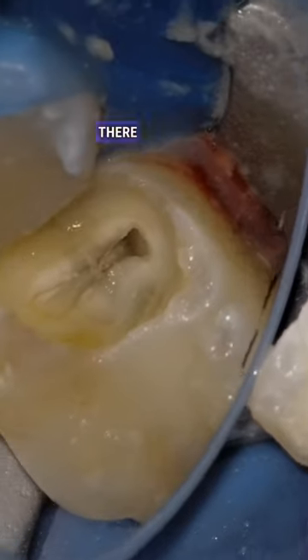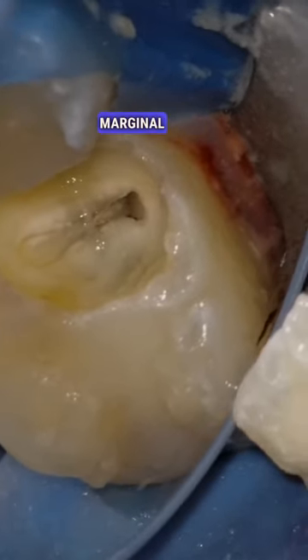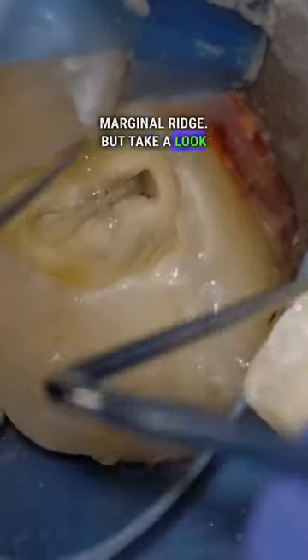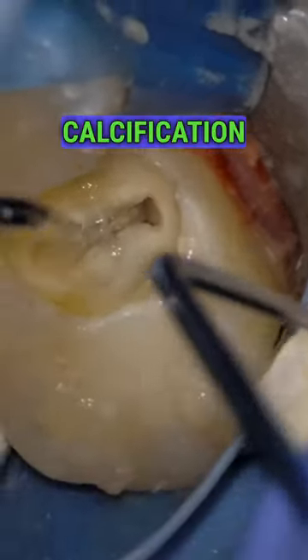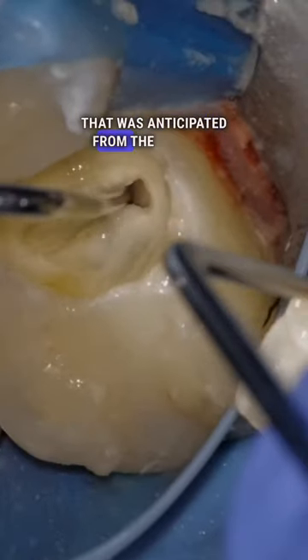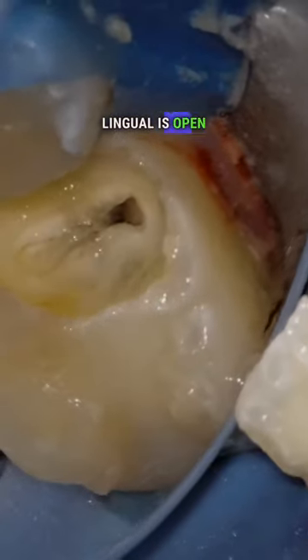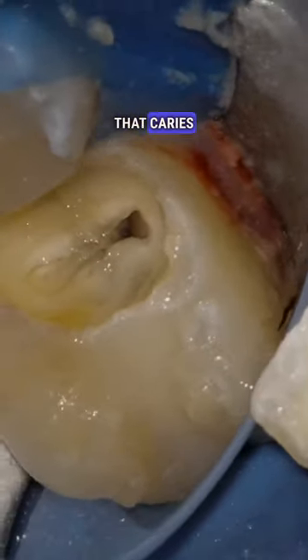This will give me an opportunity to get a better look at the underlying dentin. You can see there is a small crack on the mesial marginal ridge. But take a look at the calcification over the mesial buccal — that was anticipated from the imaging. And then the mesial lingual is open right where that caries was.